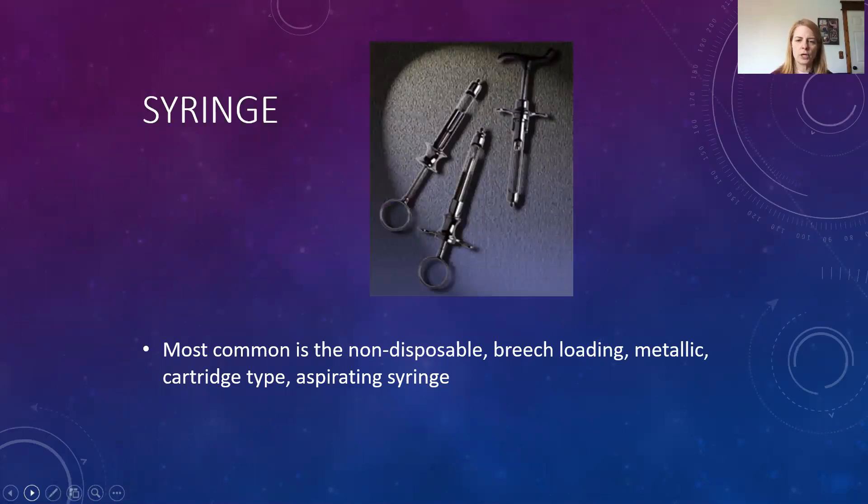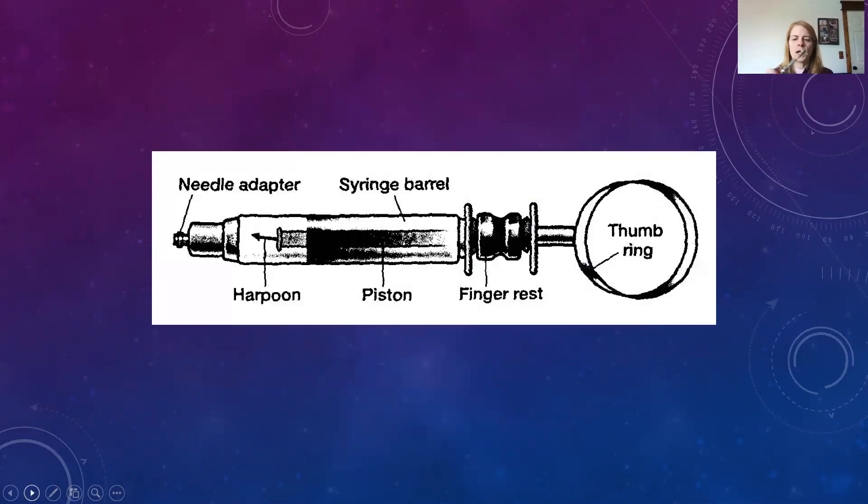The most common type of syringe we're going to use is a non-disposable breech-loading metallic cartridge type aspirating syringe. This aspirating syringe is either winged or no wings — with little wings to help you hang on. Here's our needle adapter, our syringe barrel where our local anesthetic cartridge goes, our finger rest — either winged or no wings. Then we've got our harpoon, which is a sharp pointed metal harpoon that is going to engage in the end of the rubber stopper. Our piston is going to push that harpoon back and forth.